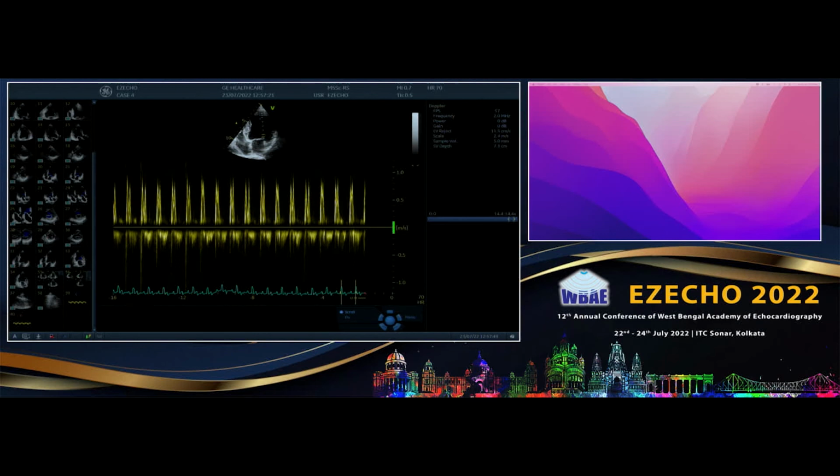Anything more you want to add? That's the most important thing, that in atrial fibrillation, you always look for less than 10% variability. That means if there is no variability, then the filling pressure is high. That is the most important factor. And obviously look at the second things like TR velocity, PH, all those will also tell you. And on top of that, if you do lung ultrasound and see comets, you know that the LA filling pressures are high, wedge pressure is high.